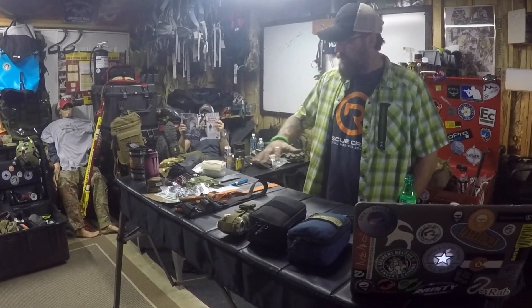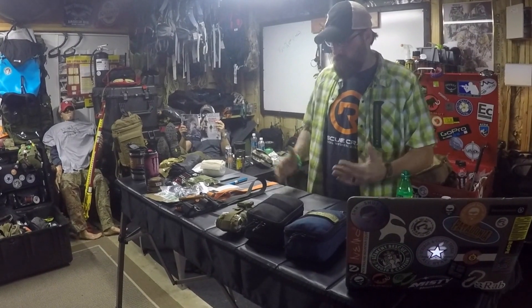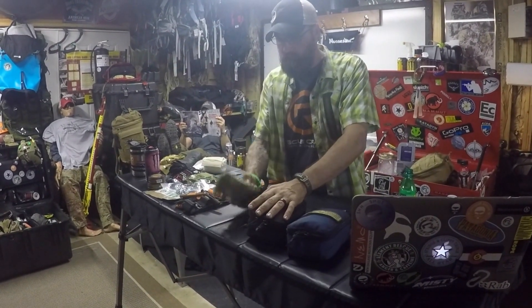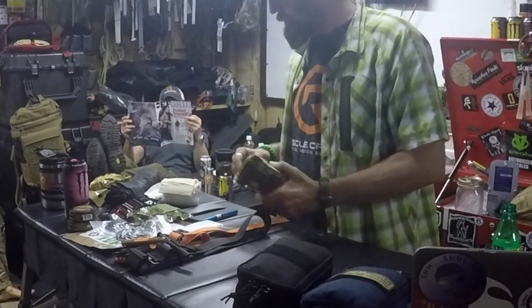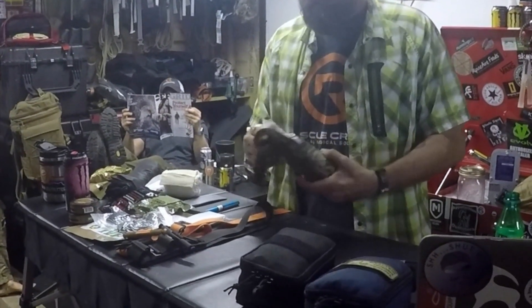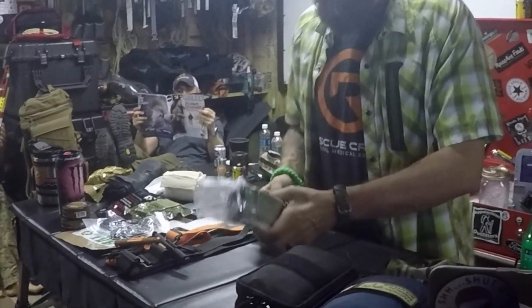We kind of got the kit out — we packed some of these kits out tonight, which will be pretty cool. We're going to start off with a straight medical kit, really small, and kind of go through what's packed into that. We're vacuum sealing a bunch of stuff, so this is pretty small.